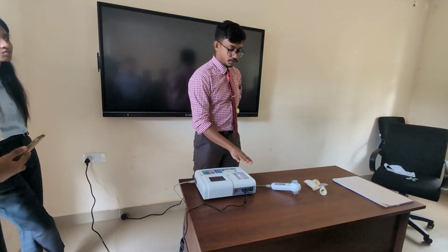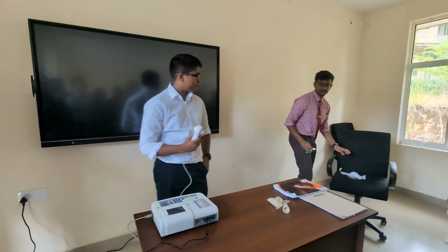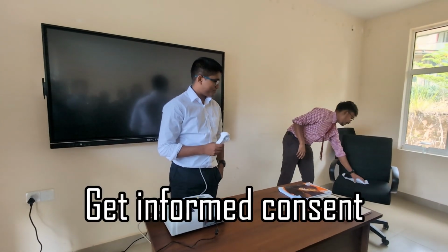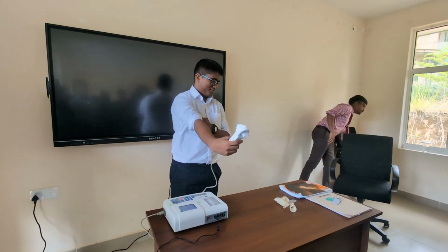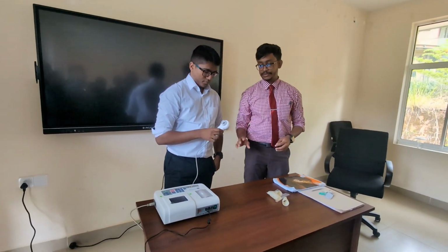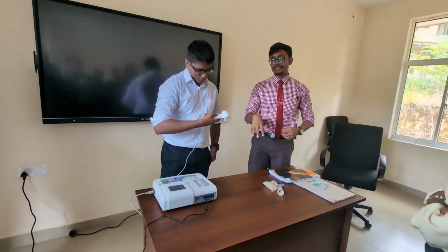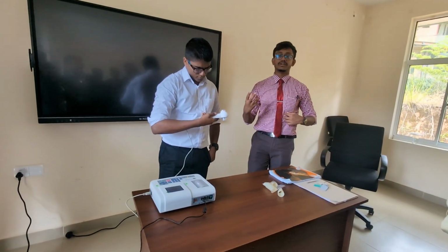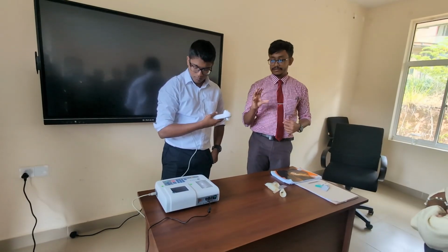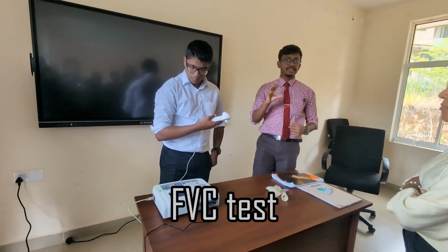So I'll show you how we use this. I need a volunteer. So first we have to get the consent from the patient as with any procedure we do. Once we do that, we have to explain that the patient is supposed to use this to get an idea about their lung volumes. And if we are using this to diagnose obstructive or restrictive lung disease, we have to mention that as well. So let's say we are now checking the FEV₁ to FVC ratio, right?